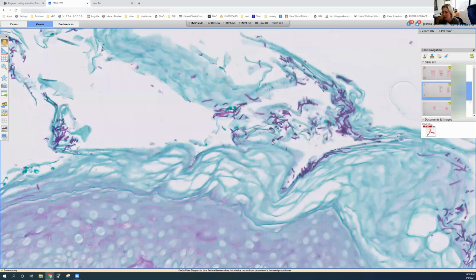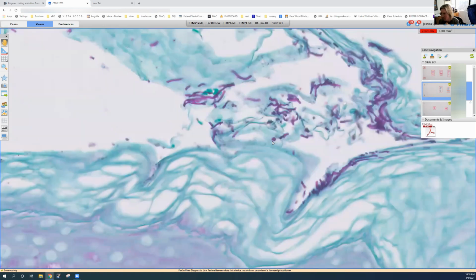and let's look around for some of the yeast. There we go. The yeast induce enlarged melanosomes or pigment granules within basilar melanocytes in the brown type of pityriasis versicolor. So when you go to make the diagnosis, you want to take the scrapings from the hyperpigmented areas because you'll get more yeast in those areas.